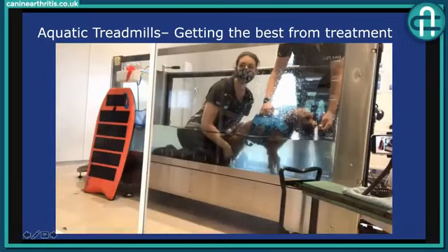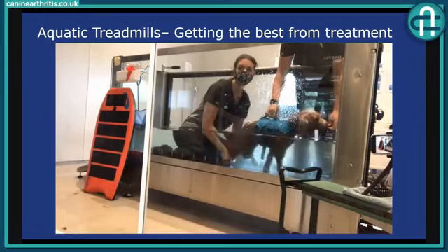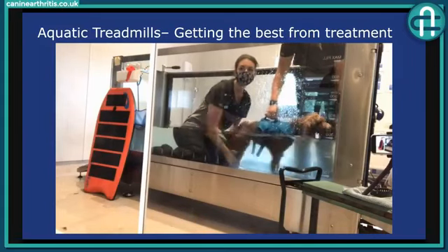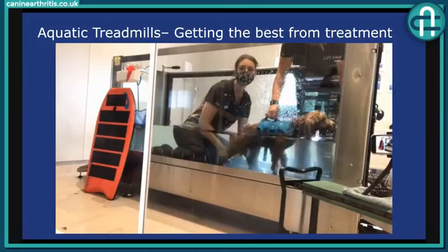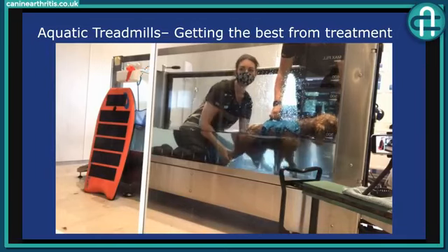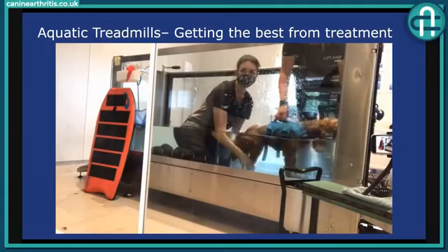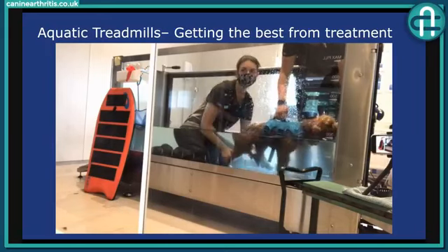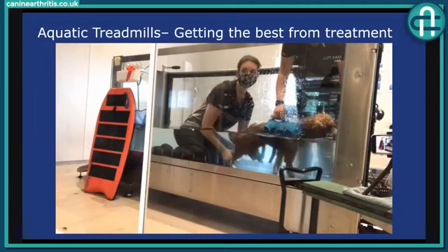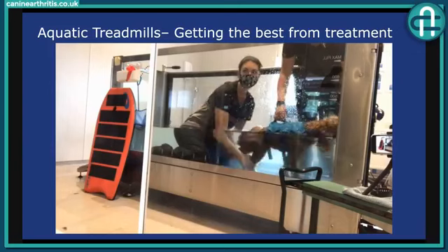So this is Remy, who is our hydrotherapist. And in this case, she is facilitating the hind limb gait. I didn't ask Remy before I left this evening whether this was a neurological case, but I just wanted to show you different examples of what we can do within the underwater treadmill. If we've got a dog that's slightly shorter in its stride on one limb, and we're comfortable that their pain is well managed, then we might facilitate a longer stride on that limb that's resulting in a shorter stride, to increase the stance time on the affected limb.